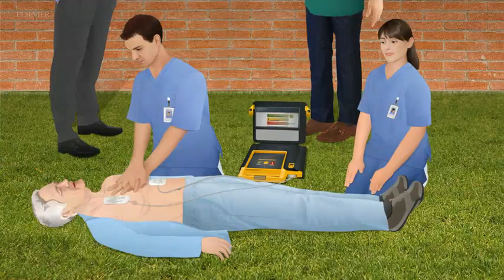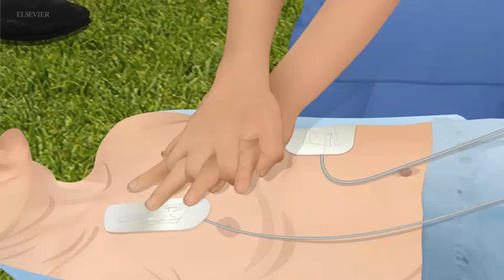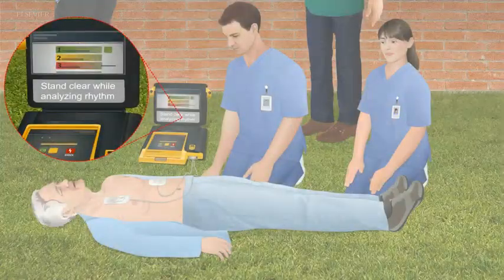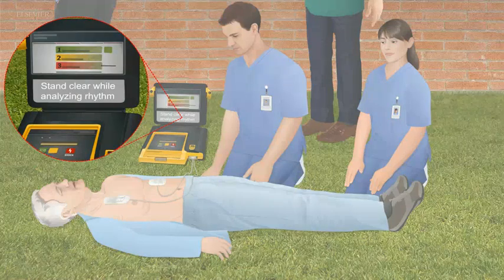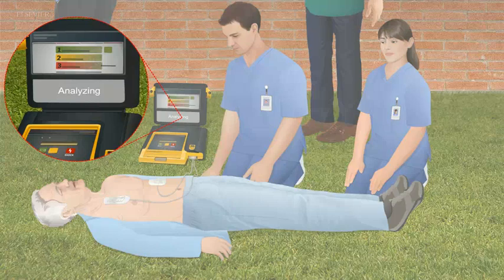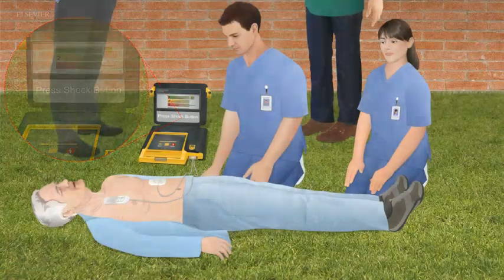Immediately begin chest compressions after the shock and continue for 2 minutes. After 2 minutes of CPR, listen for the AED prompt not to touch the patient. If prompted to shock again, repeat steps to allow the AED to analyze the rhythm.